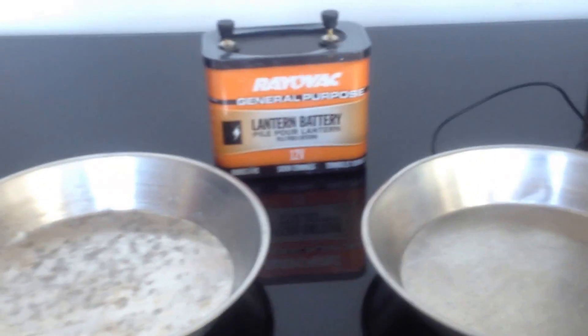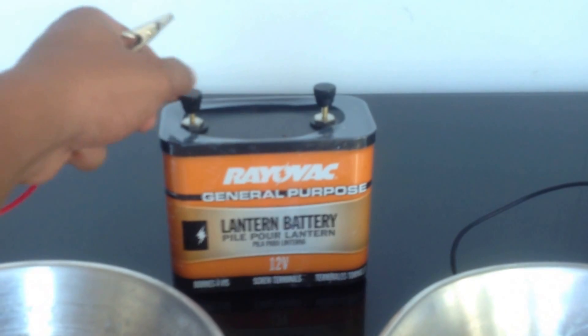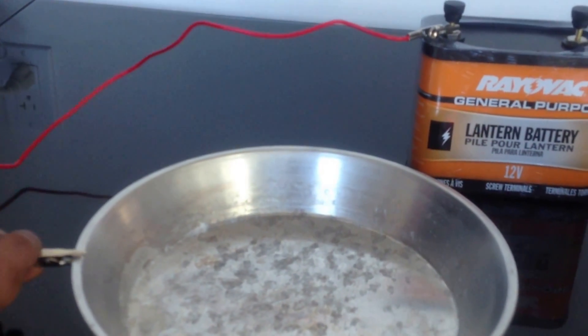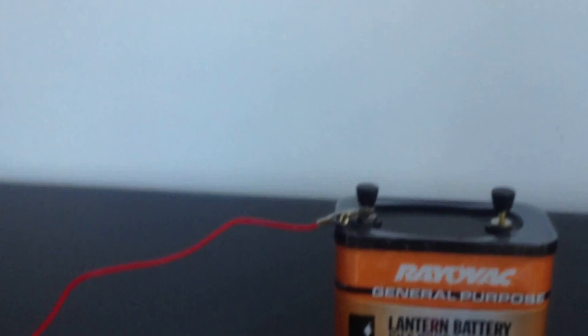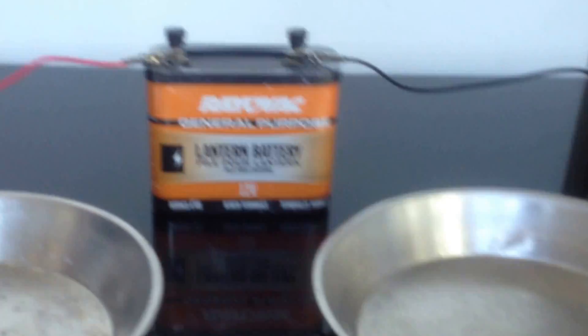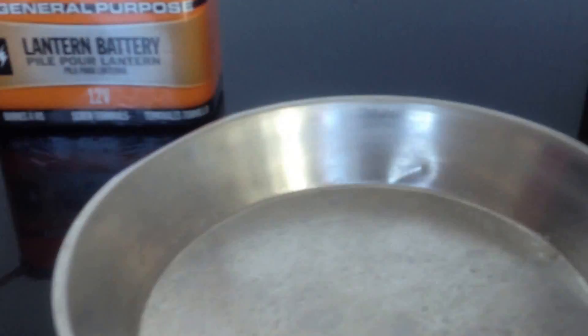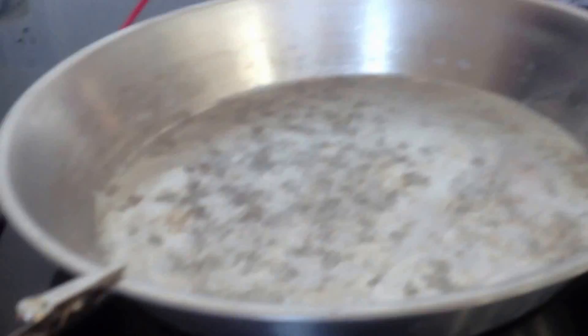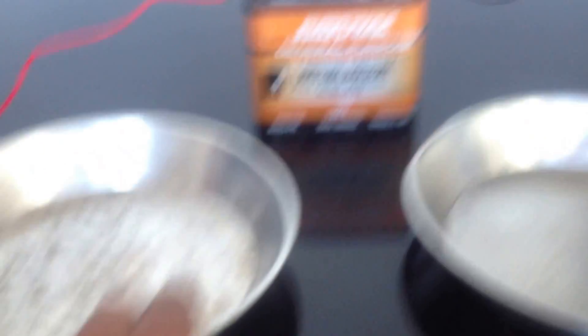So with this, you basically have your basic setup ready. All you need to do is unscrew a bit so that you can put in the alligator clip. You attach the other end to the aluminum plate. You do the same on the other end — use one end of the alligator clip to attach to the battery, and the other end to attach to the plate. So here is the basic arrangement: you have a 12-volt battery, an alligator clip going from the battery to one plate, and another alligator clip connecting the other end of the battery to the second plate.